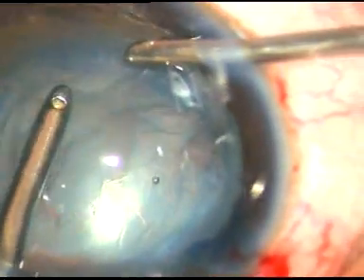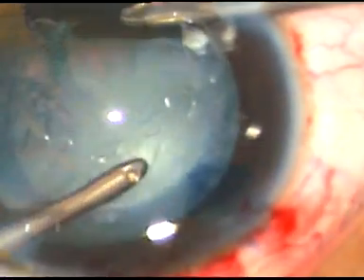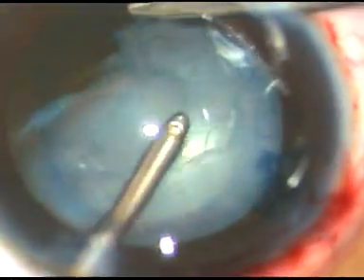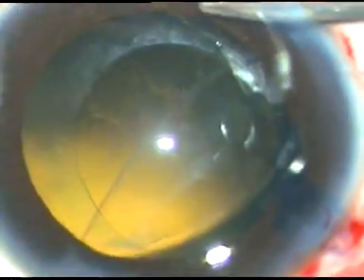Now I did not do any hydro-dissection. I just used bimanual IA and tried to remove the lens matter. See how beautifully it is coming out. The lens matter has come out, and now we can see the rent.